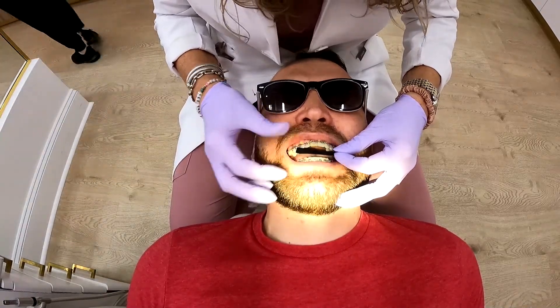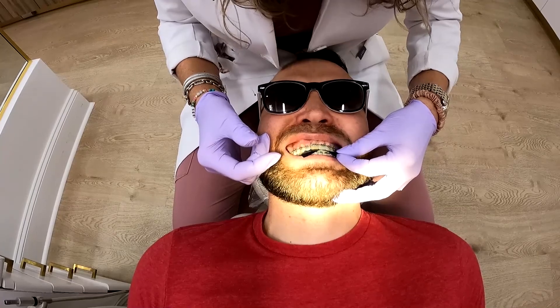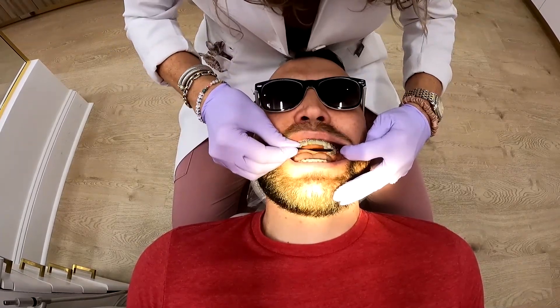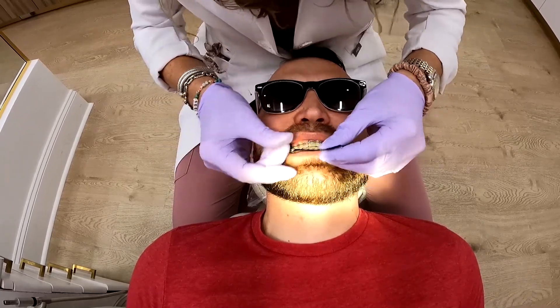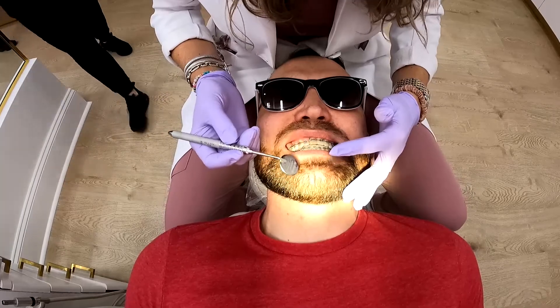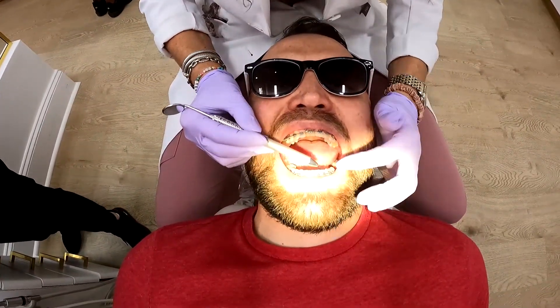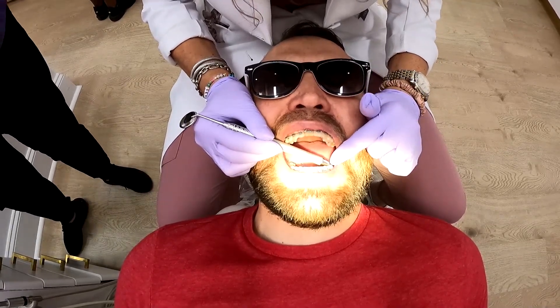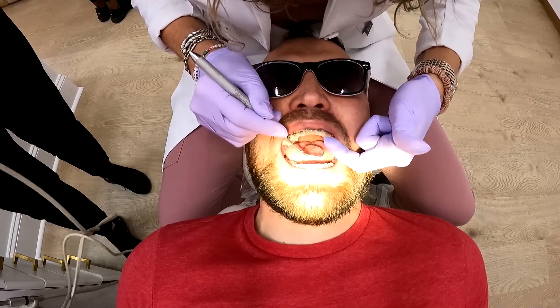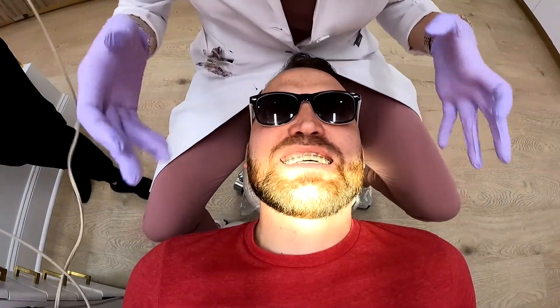I'm going to have you tap, tap, tap — bite together, and then grind. Open for me again. Same thing — tap, tap, tap and grind. Bite together, hold and grind. You see how it marks where you're hitting? You're hitting a little bit high here — that's good though, you want to have contact all the way around. Not super heavy down here, but I don't like that little corner. We're going to do a little adjustment and recheck your bite. This is called occlusal equilibration — just making some little bite changes. For most adult patients we have to do this to make sure your bite feels good at the end.